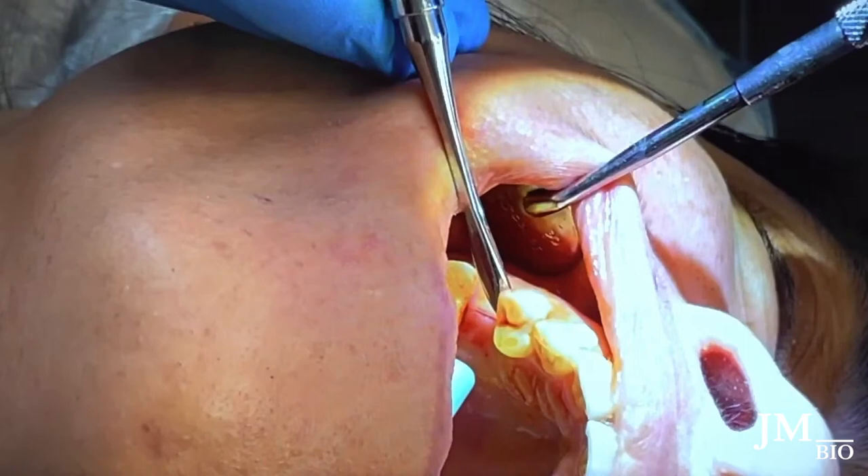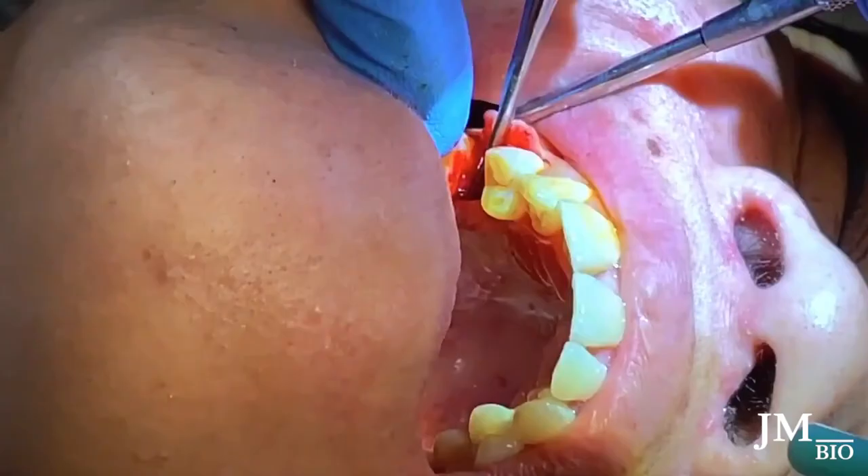I create a little lingual flap reflection because there's quite a bit of tartar on the mesial of tooth number three. You'll see me taking the periosteal elevator and scraping the tartar off that tooth — that's free SRP for the patient.